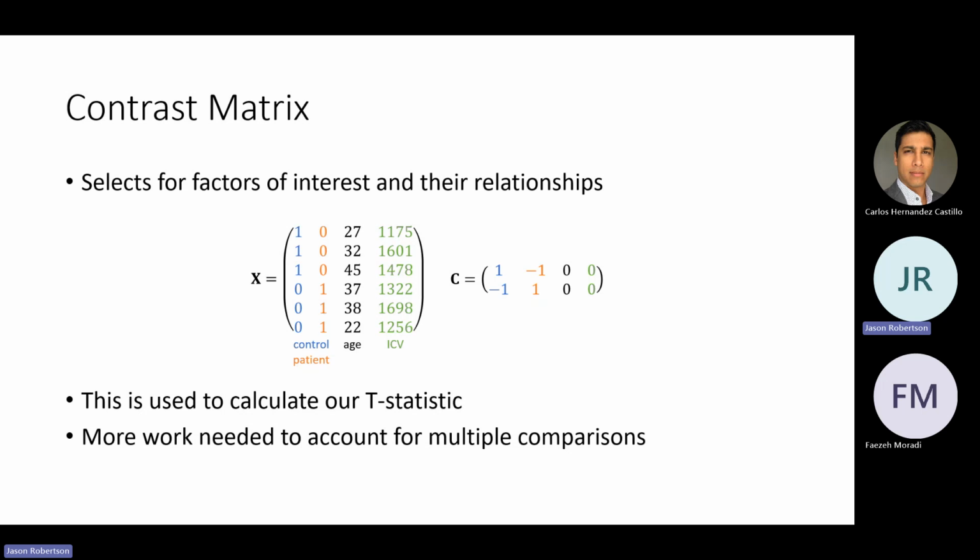Just before we go there, remember that every time you use stats, we care about the p-value. 0.05 is what science says is okay. But in the brain, a GLM is not taking one signal, but the values of each single voxel.